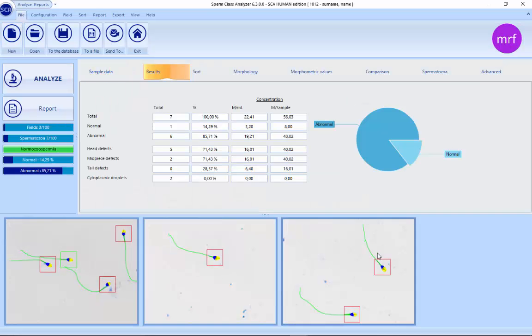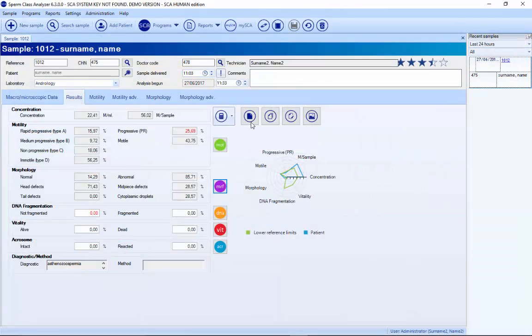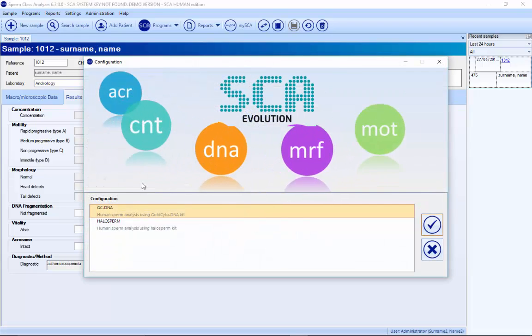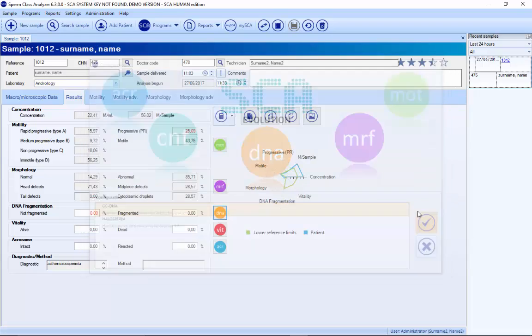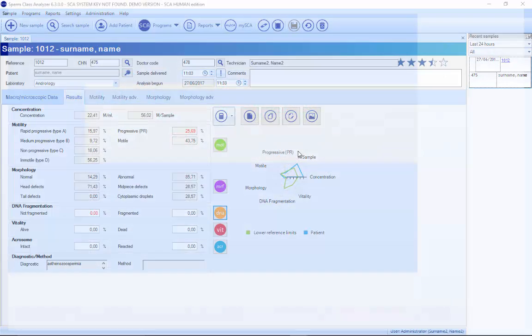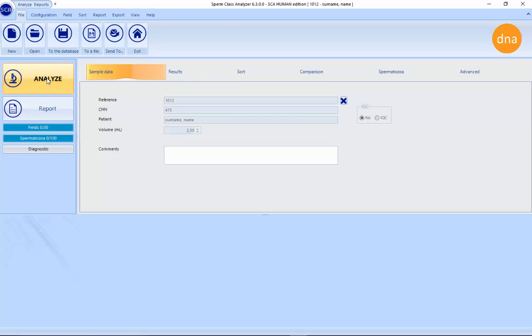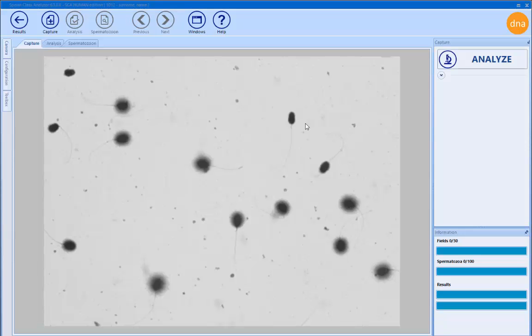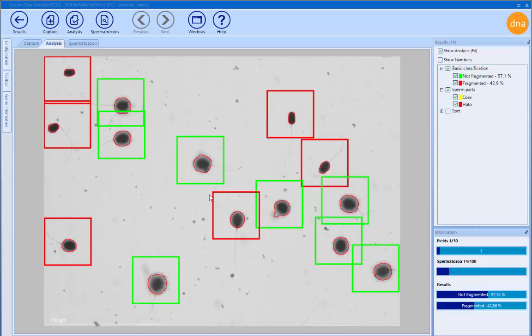Once all fields are analyzed, you need to analyze 100 sperms. When you exit, everything saves automatically to the database. It's also possible to analyze DNA fragmentation using the Halosperm DNA kit. You put the sample in, and when you press analyze, the system automatically detects each sperm and whether it is fragmented.